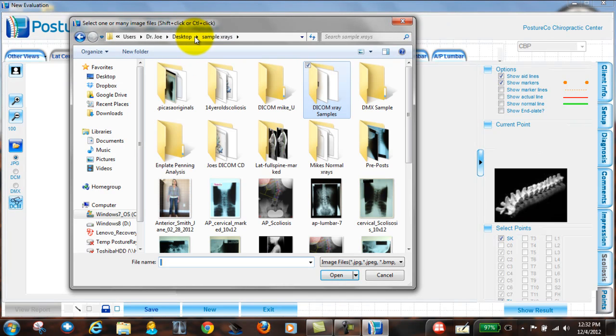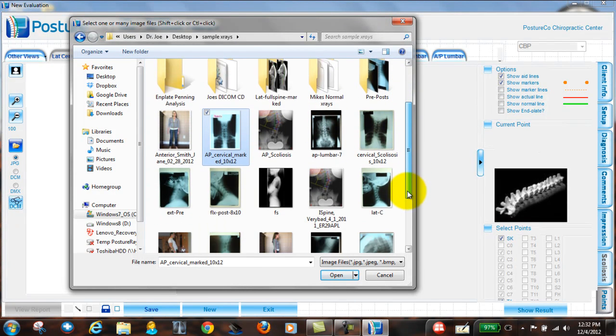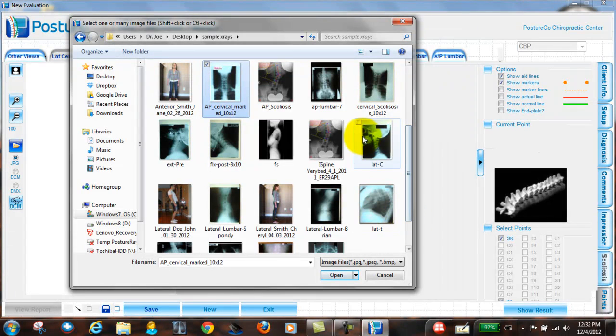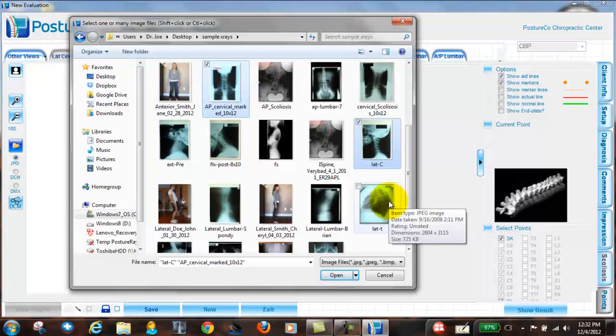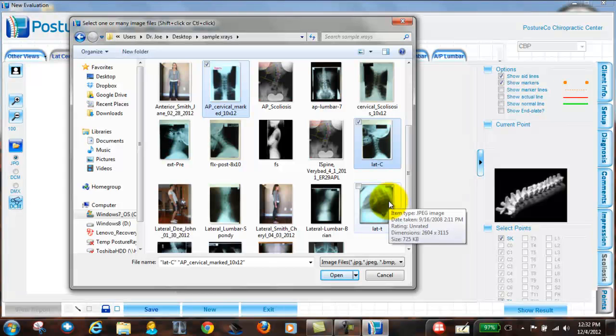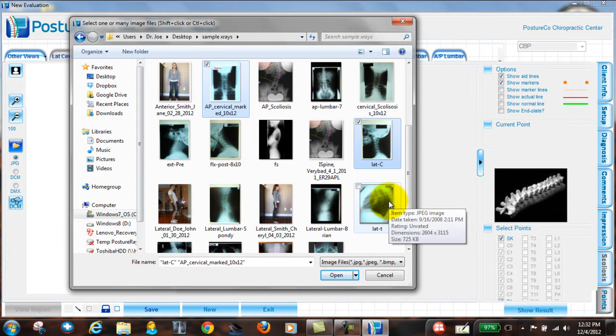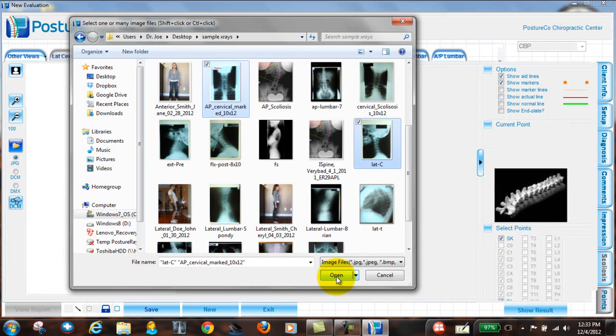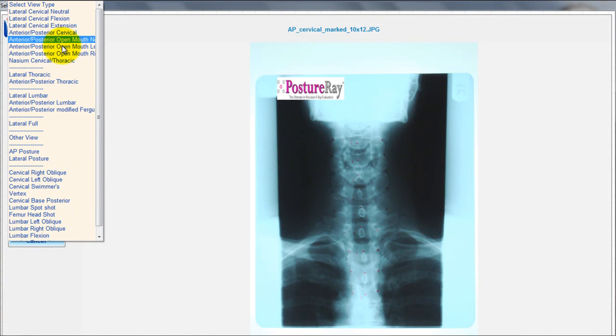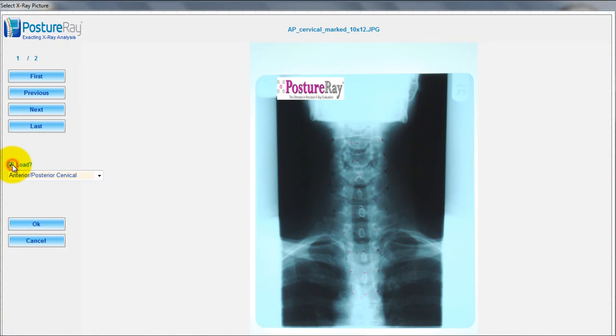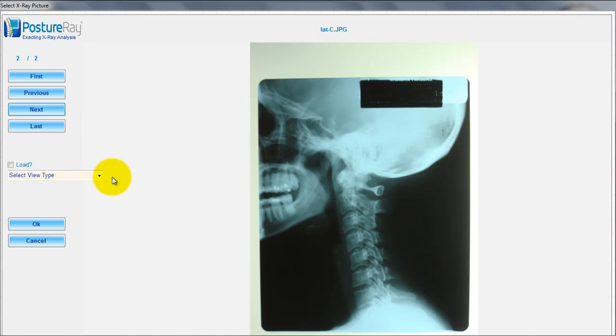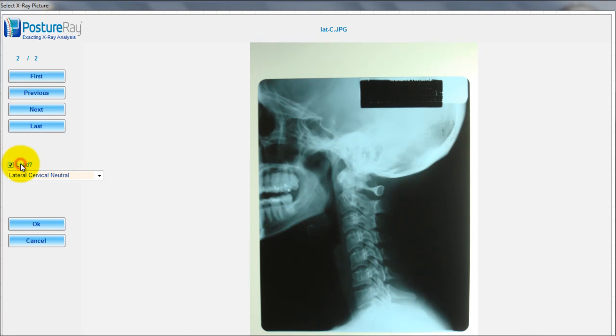So now, what we do is we browse through those images, and here we can see there's an AP cervical. So I'm going to just hold down a control button so that when I'm ready to select the next one, and let's do this lateral cervical. So it doesn't matter where you save them, but what I would do routinely is I would take a picture of the X-ray jacket with their name, the date, their date of birth, any other information, then take pictures of all their X-rays. Then the next patient starts with the next X-ray jacket. That way everything's in order. You don't have to manually name everything like what I did here. I just did this for tutorial purposes. Now, you'll see you get that same screen that comes up, and I'm going to do an AP cervical. So I go in here, AP cervical, load, and then you can see I got two images that are loaded. So let's go ahead and do that, and then lateral cervical, neutral, and then we're going to hit load.